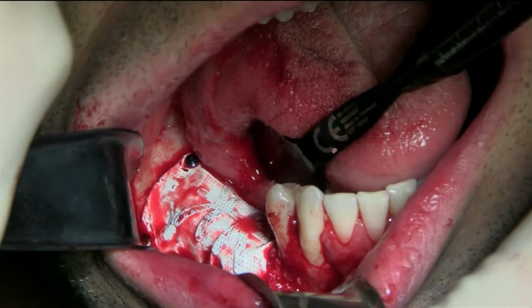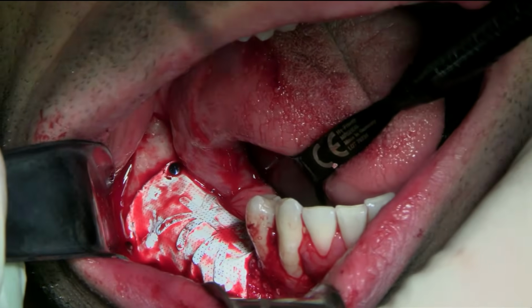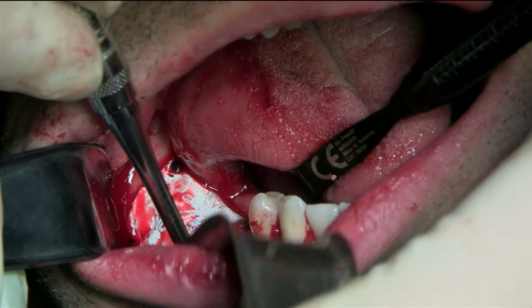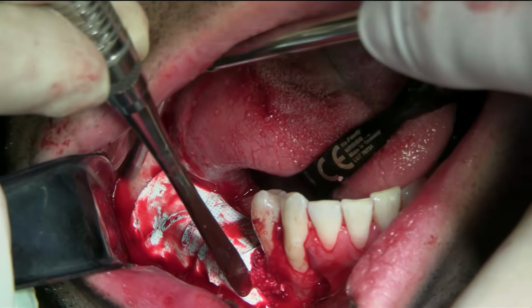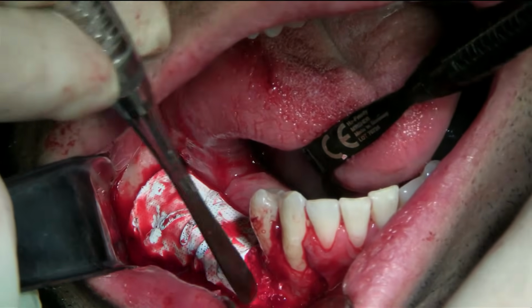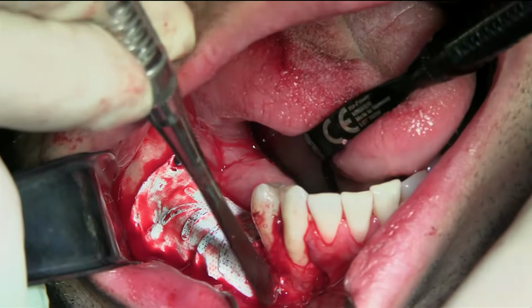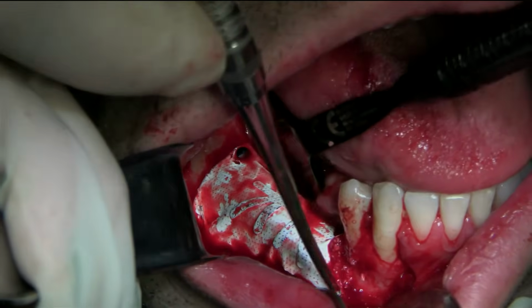Hold the back one. Hold the back one. The back one. This one. That's fine. Can I touch one at the base? Hold on a second. Okay, a little bit left, a little bit left.